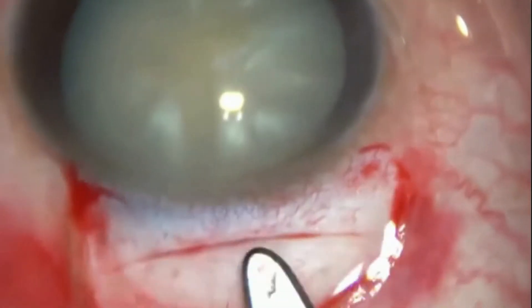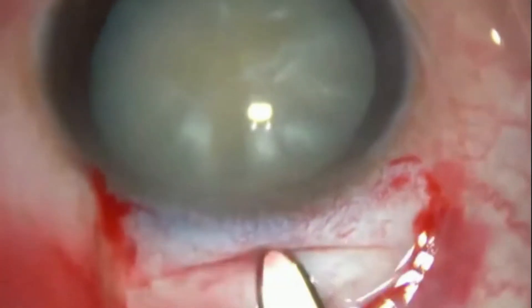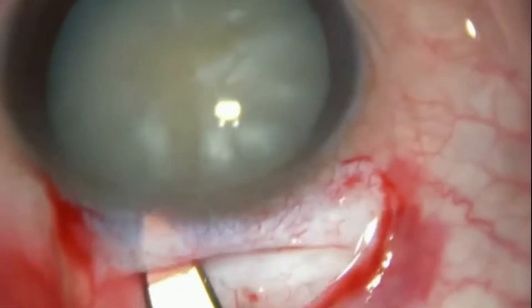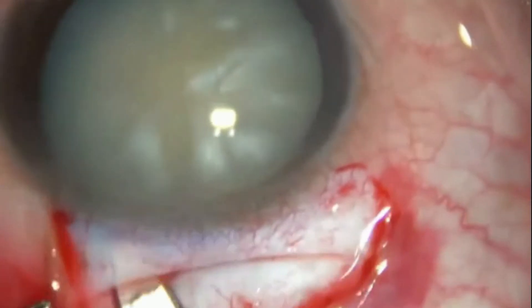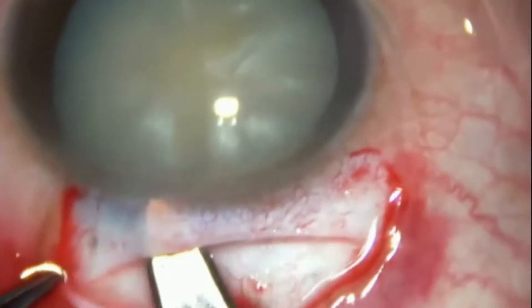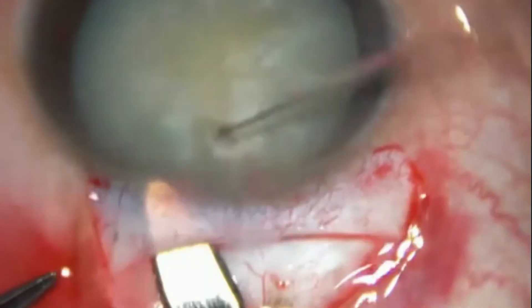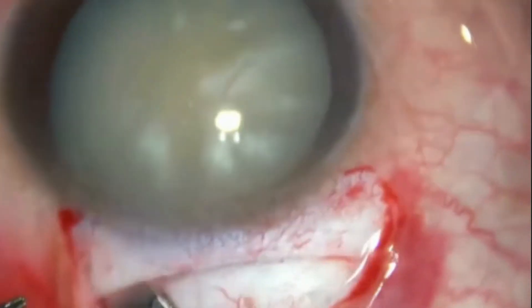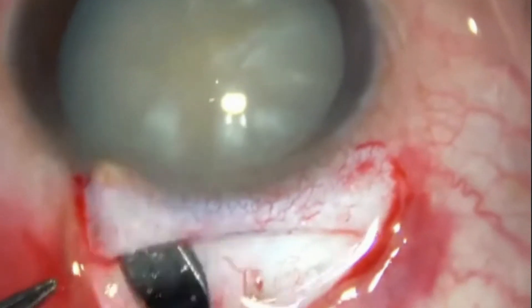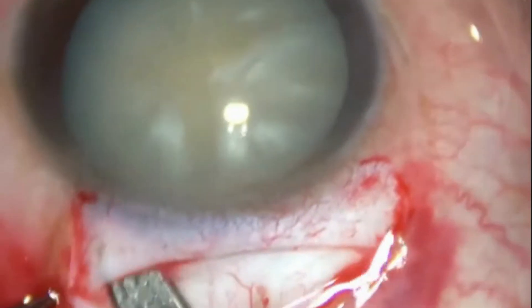With a half-thickness sclerocorneal tunnel incision, the direction of the crescent knife should always be parallel to the sclerocorneal plane. Judge the depth of the half-thickness sclerocorneal tunnel incision by observing how clearly you can see the crescent knife during the incision.